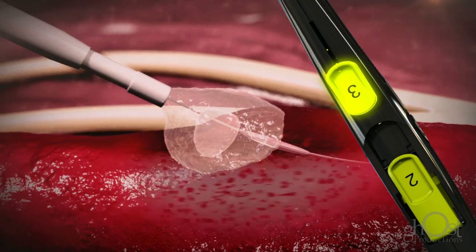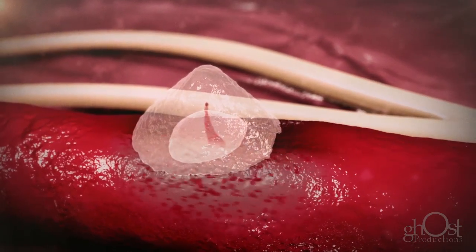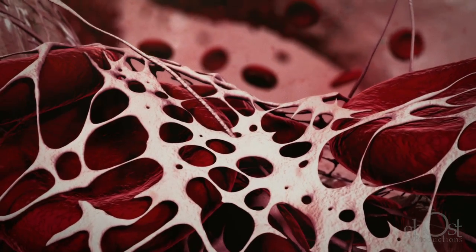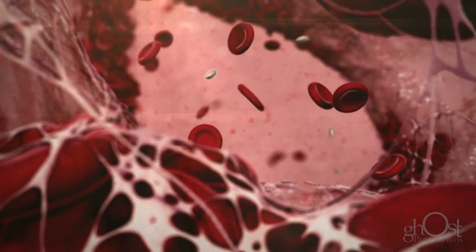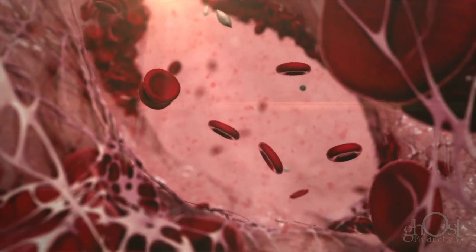After the balloon is deflated and the device is removed, the sealant instantly absorbs blood and fluids. Platelets and blood cells continue to collect inside the sealant's porous matrix, causing the sealant to swell three to four times its original size.